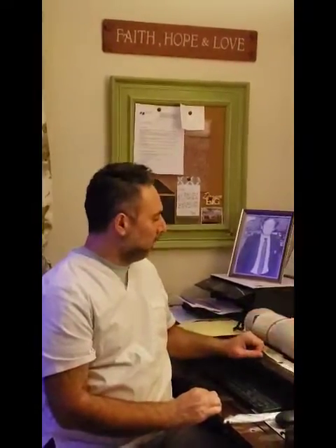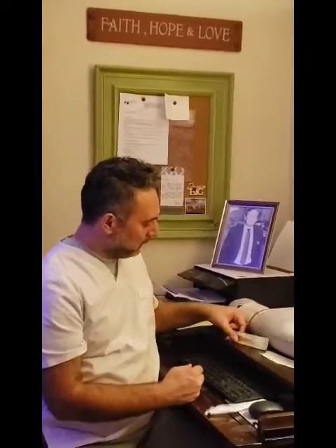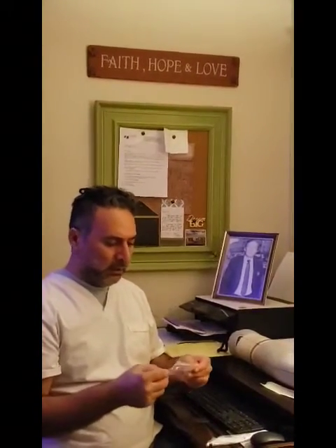And the last type of injection that I will be talking about would be the insulin injection, subcutaneous, also known as sub-Q, which is for administration of insulin, heparin, or vitamin K. For this type of medication, our syringe doesn't go by milliliters anymore. We go by units. It's usually between 0 to 100 units.